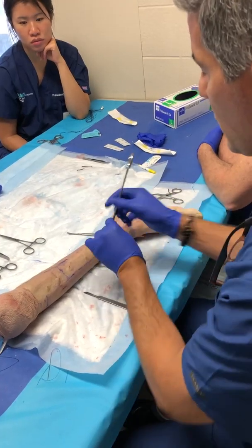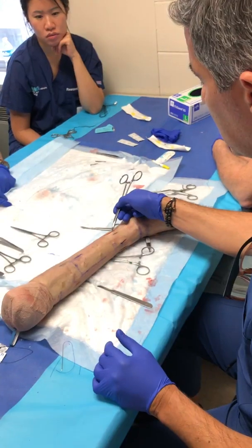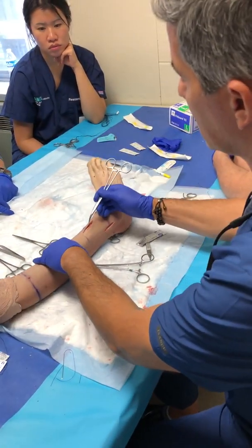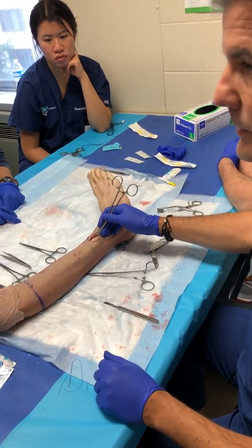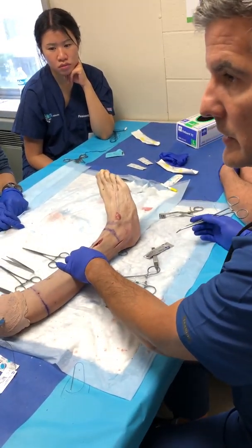Okay. Here you want to inferiorly retract the tibialis posterior, exposing the medial border of the tibia. Here you want to lateralize the tibialis anterior, exposing the lateral aspect of the tibia. And then here, whatever you want to go and target this.